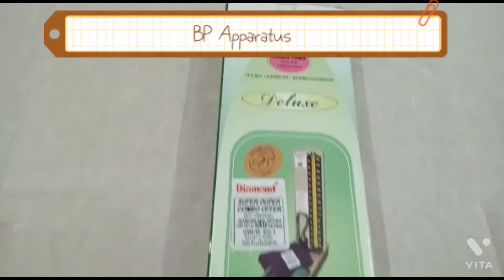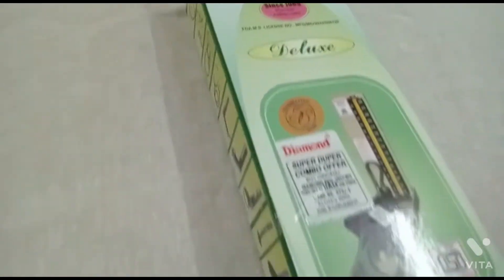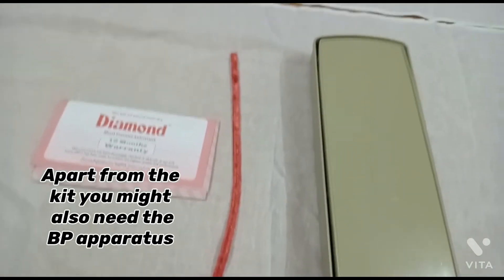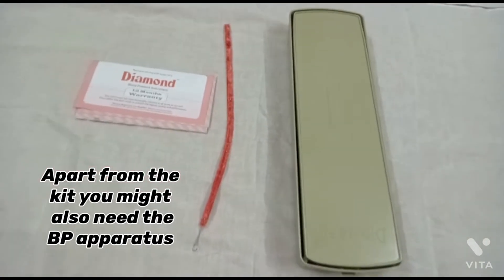Next is the BP apparatus. Apart from the kit, you might also need the BP apparatus.